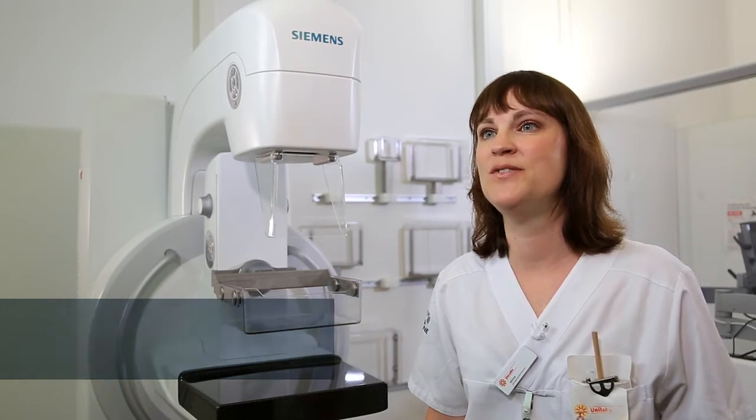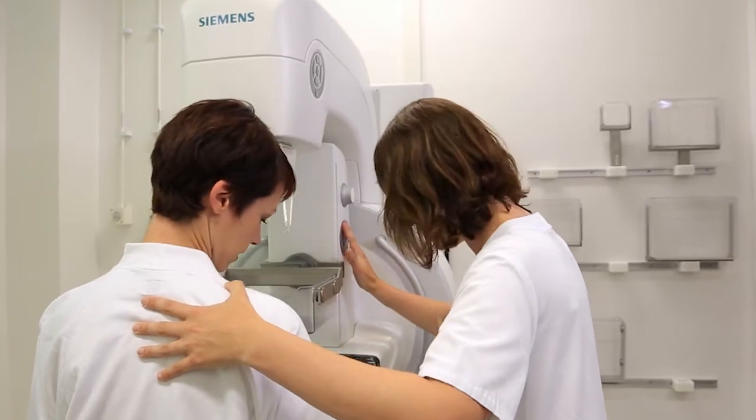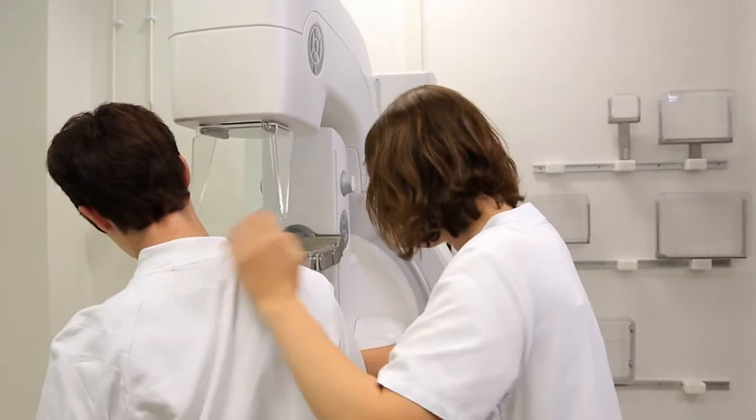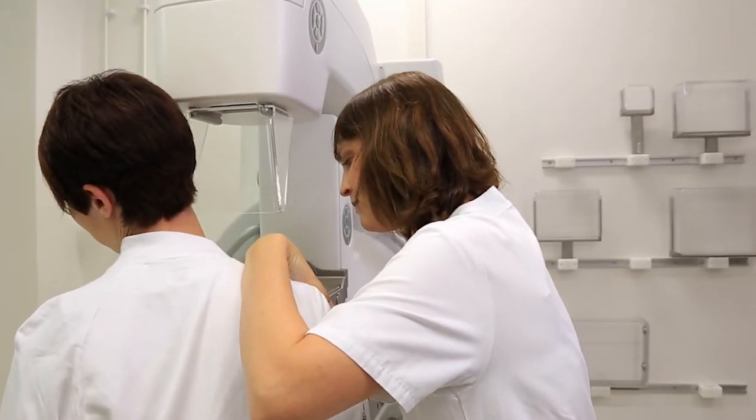I am Ulrika Pettersson from Malmö, Sweden. I like working in mammography because it was my mission from the beginning to be a mammography nurse. The very high number of patients we have to examine every day is the main challenge I have, so I need to perform the examination quickly, accurately and with as little discomfort for the woman as possible.